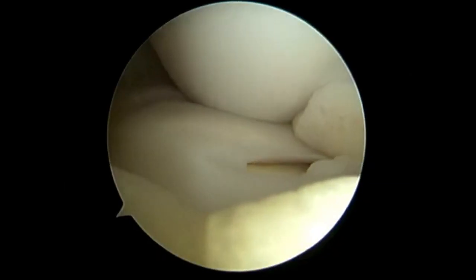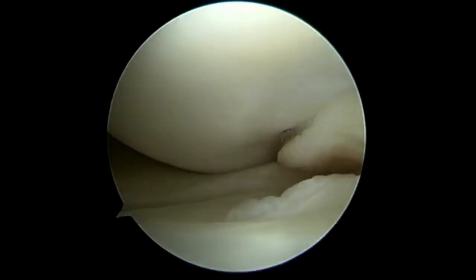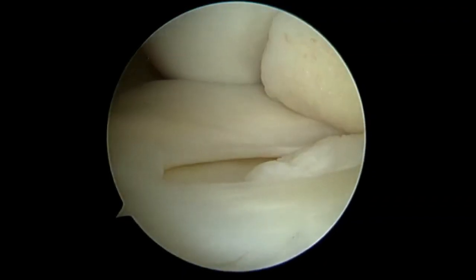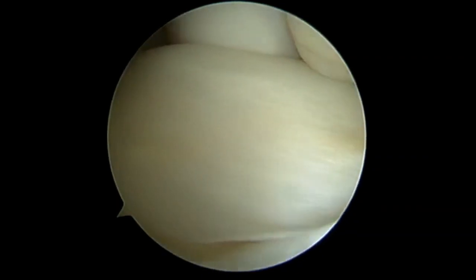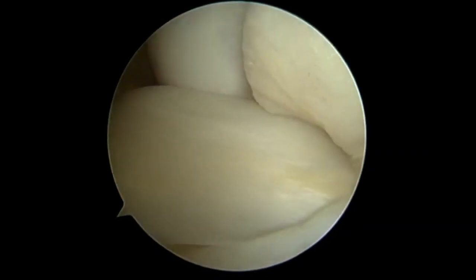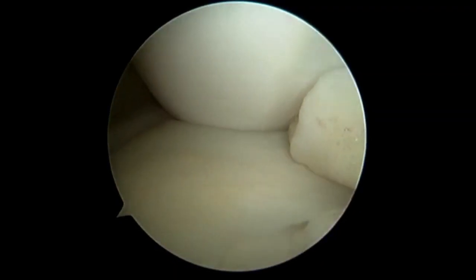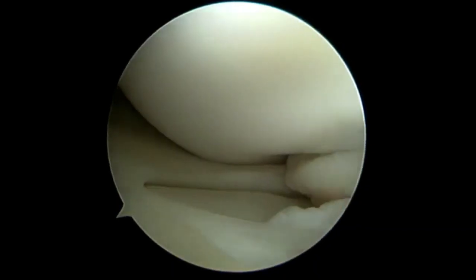Following the preoperative exam, a diagnostic knee arthroscopy was performed through the inferolateral and inferomedial portals to visualize the discoid medial meniscus. The stability of the meniscus was also assessed. As shown here, as the knee was flexed, the posterior horn of the meniscus subluxated anteriorly. This coincided with the patient's snapping sensation in her clinical presentation.